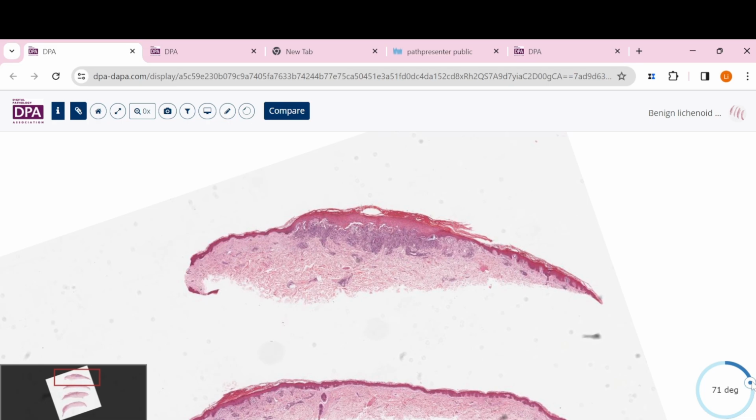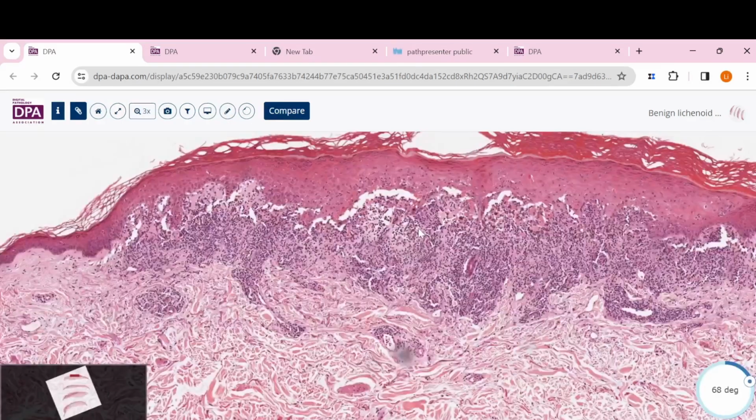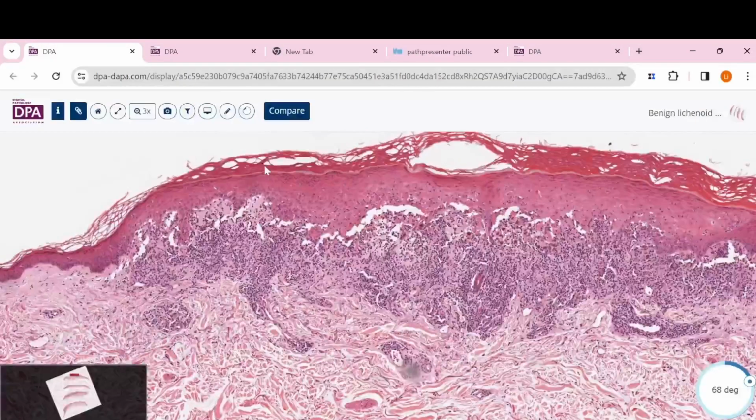And then the DEJ junction, because it is attacked by the lymphocytes, so they kind of fall apart. And then we can see some pigment drop out here. And then pyramid hypergranulosis, and then with a lot of dying keratinocytes. So this one is another case of BLK.